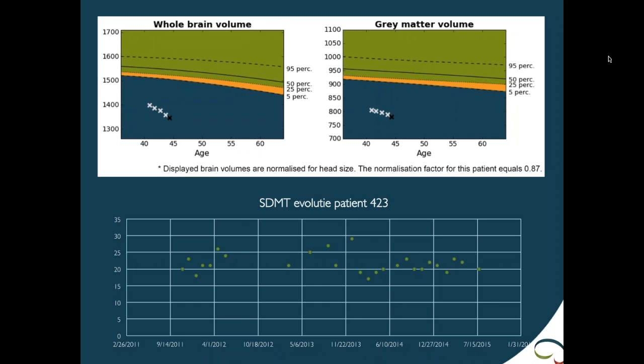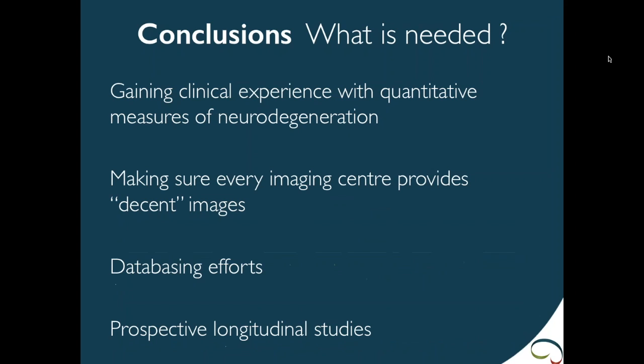So in this patient, unfortunately, the measures confirm my clinical suspicion that we're not doing that well with the patient. And this also helps me to communicate with this patient because he was interested in seeing these measurements. It helps him understand that things are unfortunately not going very well and that we might not be on the right treatment schedule for him for this moment. Of course, the question then is raised, what should we use to treat people who have extensive neurodegenerative activity for their MS? Hopefully the next few years will bring valuable therapeutic alternatives for this group.